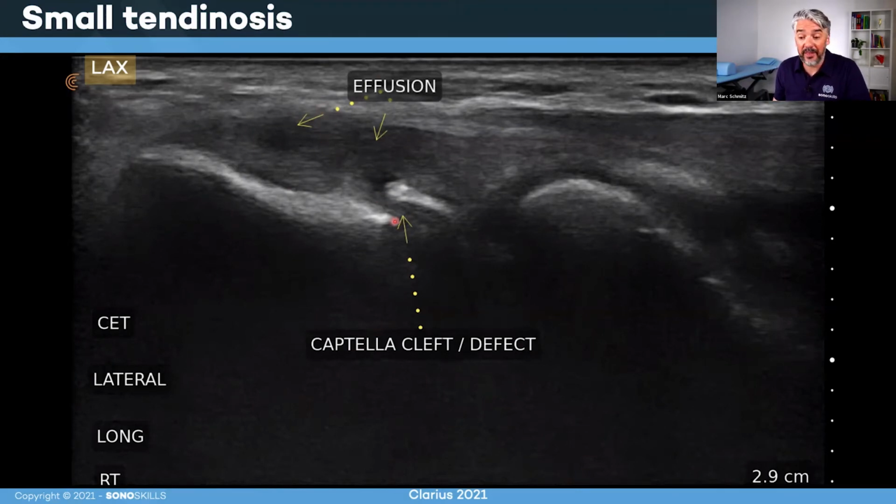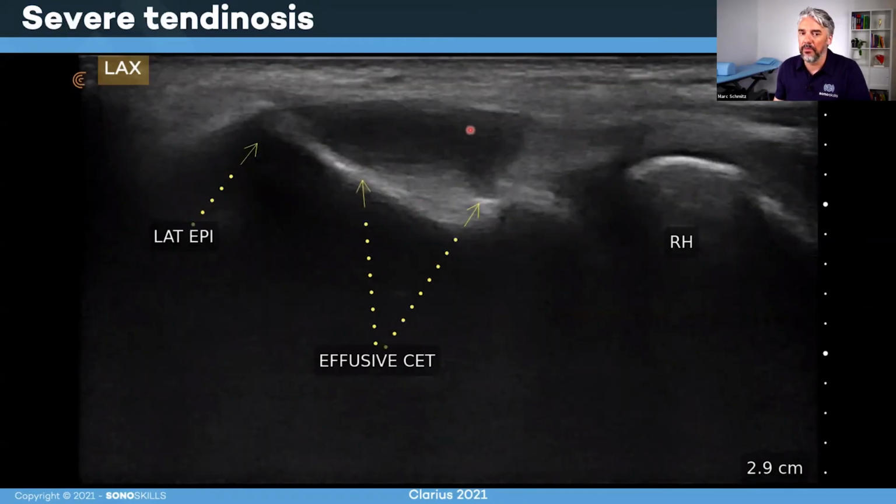And it's not only about the tendon, there's also a bony change. Look at the irregularity of this bone right there. This is an osteophyte, real close to the humeroradial joint. And we would expect it to be smooth, but it's spiky, like an osteophyte. This is a really dark zone, and this is a severe tendinosis. You can see, of course, the swelling and that it's really, really dark. See the difference with this. This is how it should be.